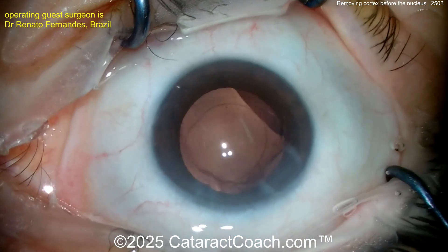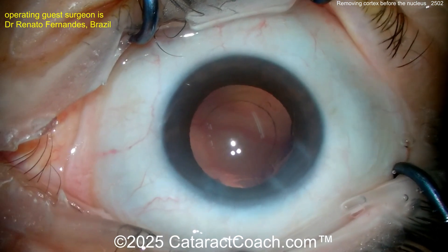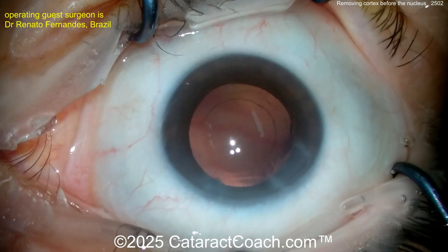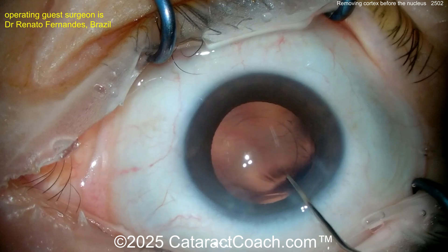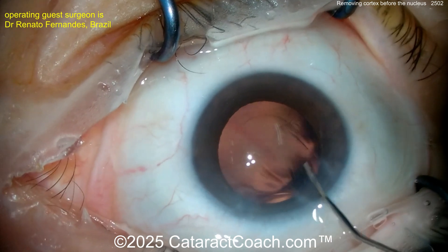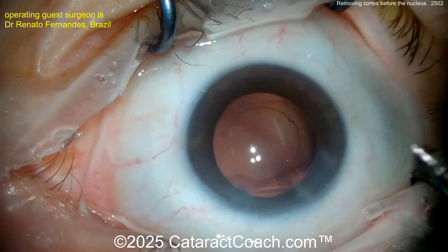Primary cortical aspiration — really very interesting. A lot of surgeons doing very high volume, like in the public health system needing to do 100 cataracts a day, are always looking for little things to make it more efficient. There's a tiny bit of lens cortex there, but it's manageable.